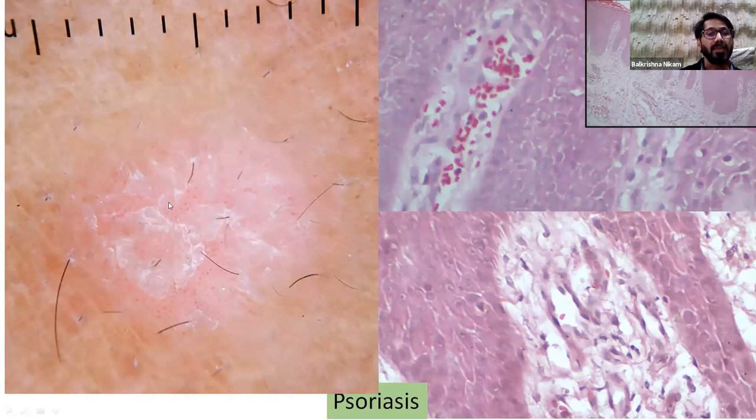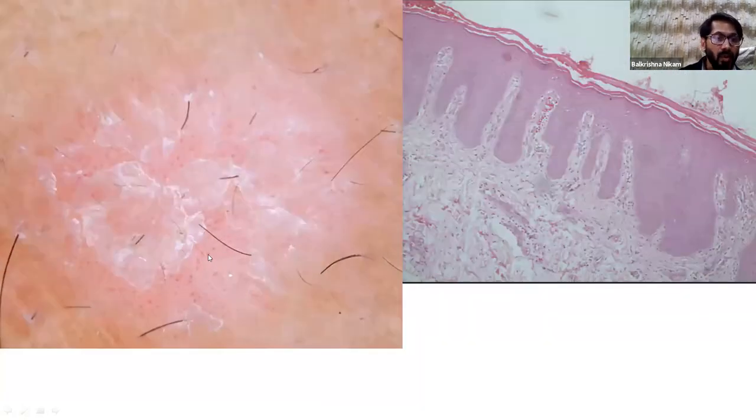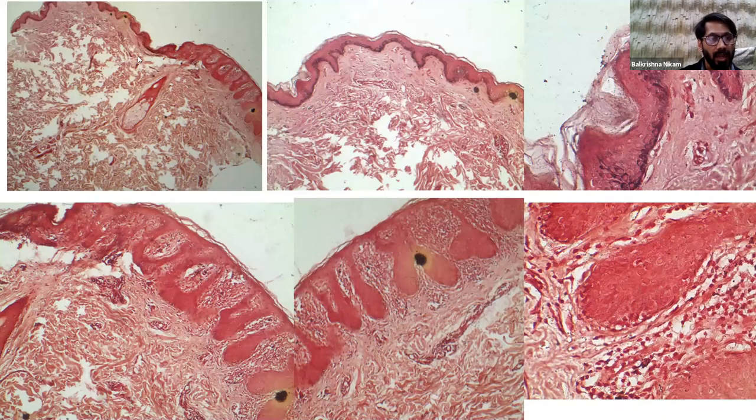But why are they visible? They are visible because the superficial epidermis is totally lacking pigment. If you observe, these red globules are nothing but the mesh of the white network. So we are actually ignoring the white network in between, and this white network correlates with the demelanized, elongated rete ridges, which form this thick or thin white network. This is proved in the excisional biopsy from the edge of the psoriasis lesion.